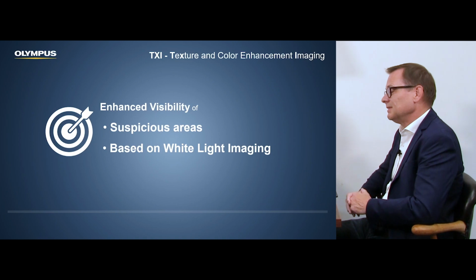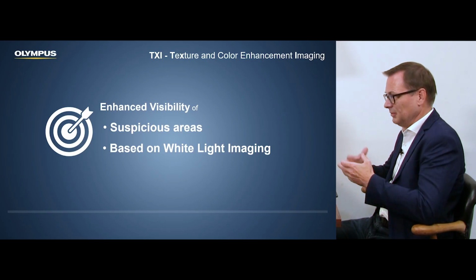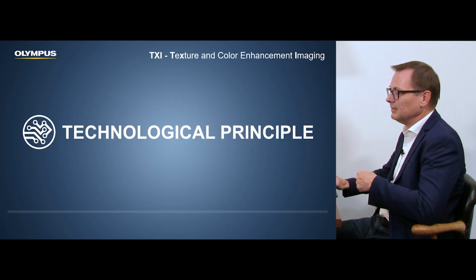The idea of this function is to indeed increase the visibility of any kind of suspicious areas, but different from NBI, this should keep the color representation. You all know NBI changes the color setting. TXI is not really doing it. It keeps the impression of a white light image.